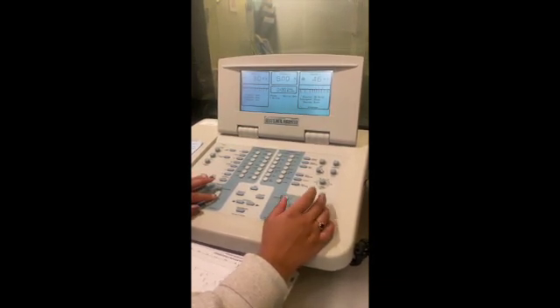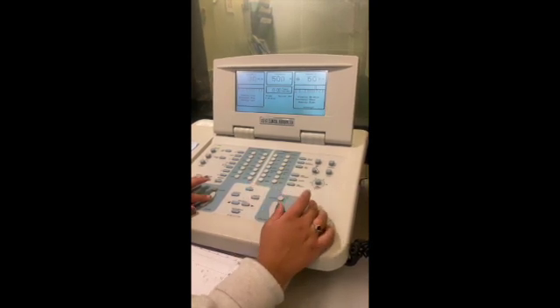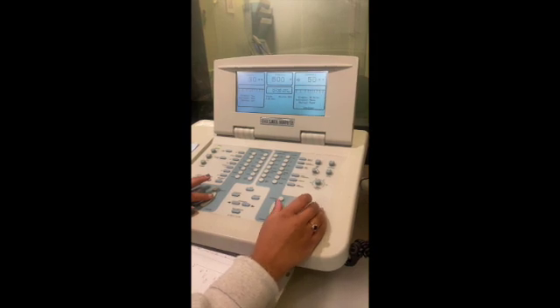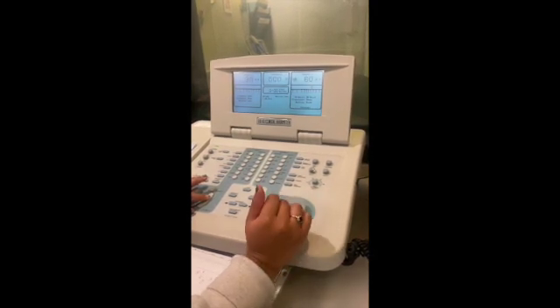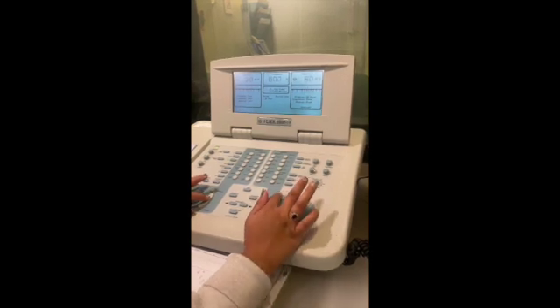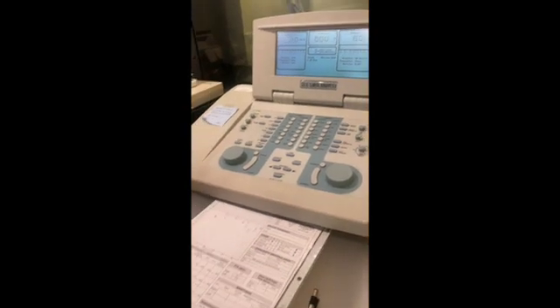So now I'm going to begin plateauing. So I move this up 5 dB. The first one you count as 0, that's the initial response. So let's present it. They heard it again. I'm going to go up another 5. Let's present it. Okay, they heard it. And now we go to 60, which is the third time. And they heard it. So now you have your plateau and you have your mask threshold. You turn off interrupt, and then you record your threshold.